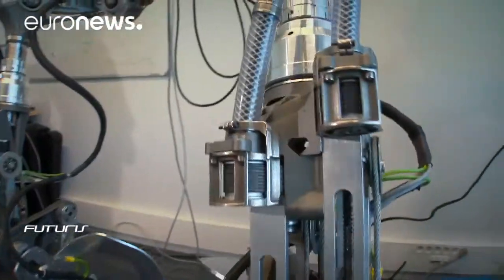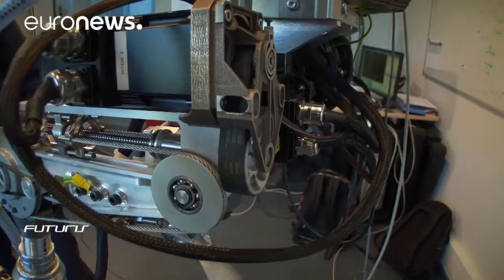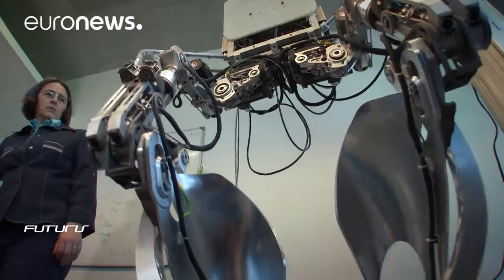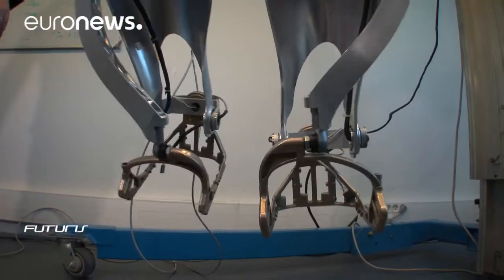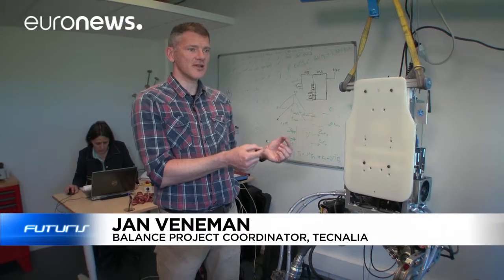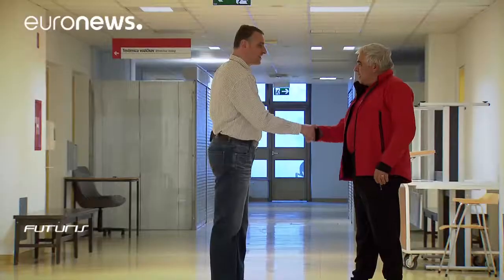Computer researchers and engineers from several countries are working on final adjustments before human testing. The main challenge maybe is in the control of how to collaborate with the human. We don't want the exoskeleton to take over control and walk like a robot, let's say, with a human inside, but we want the exoskeleton to help the human when this is needed.